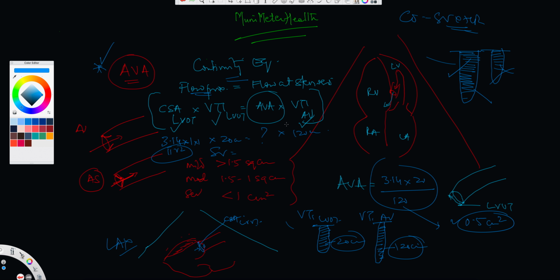Okay, so I hope this segment was very helpful to all our students, residents, and fellows, and of course colleagues like me who've been in practice for a long time, but we tend to forget, or sometimes just don't recall what the continuity equations are and what have you. Of course, now there are technologies which will actually measure the aortic valve area right there as soon as you compute all your parameters in, so you don't even have to bother with the calculation. But this is how it's done, and it's good for the exams.